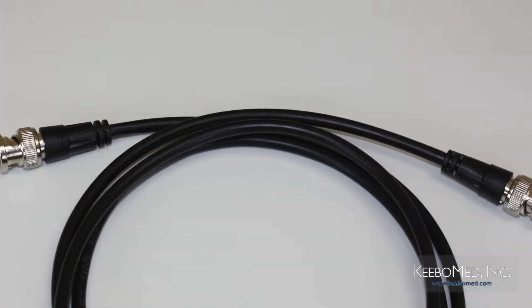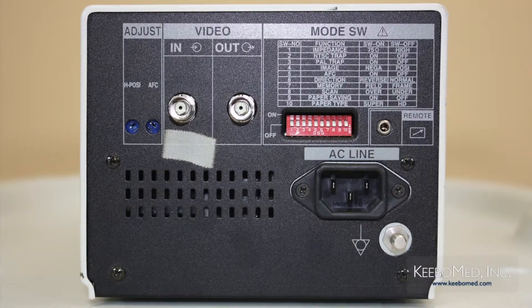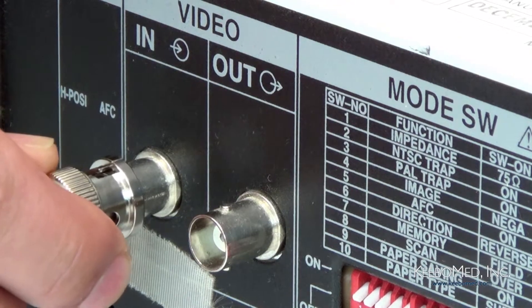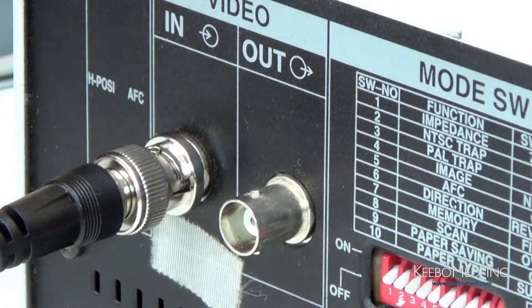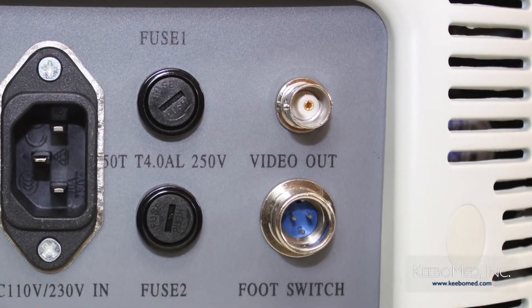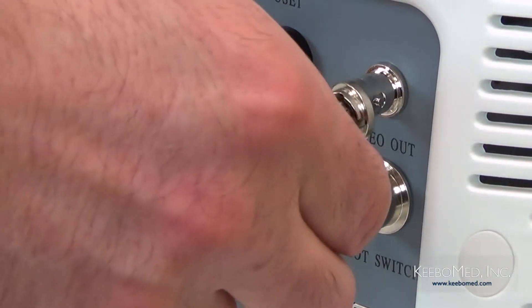Step two: connect one terminal of the video cable to the video in socket at the rear panel of the video printer. Connect the other terminal of the video cable to the video out socket at the rear panel of the ultrasound.